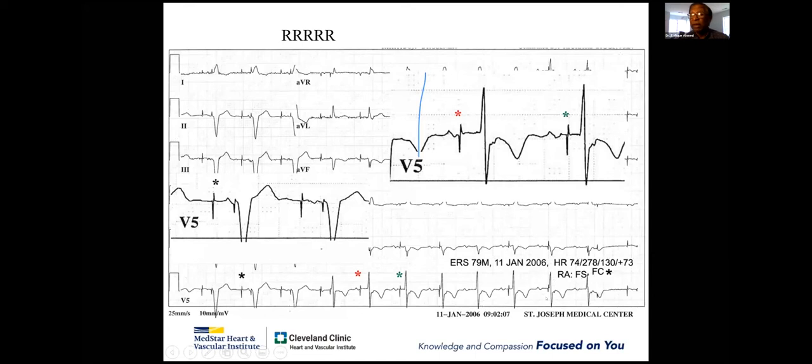What would happen? Somebody with complete heart block has the atrial pacing, and the atrial pacing spike is seen by the ventricle, and it stopped pacing the ventricle. And it happened quite frequently, and they introduced this feature called safety window pacing. So this is not a malfunction. This is a normal function. Please remember this. Thank you.